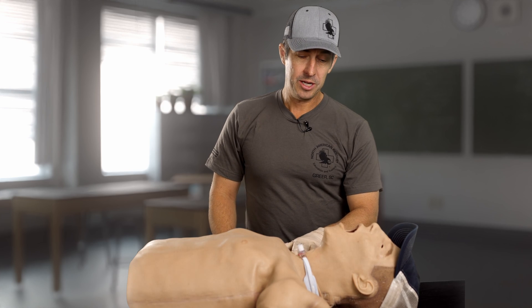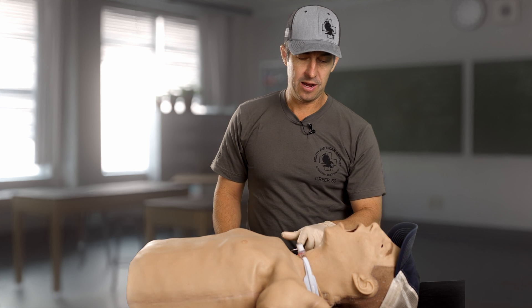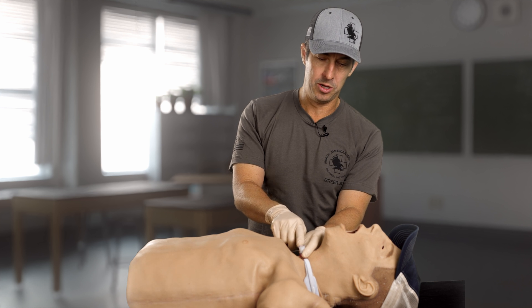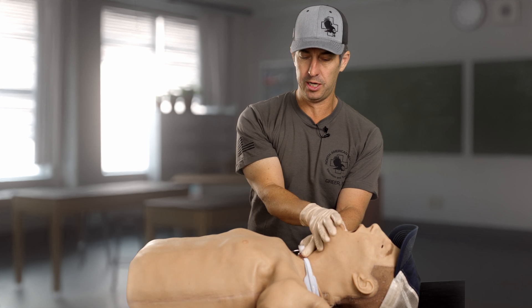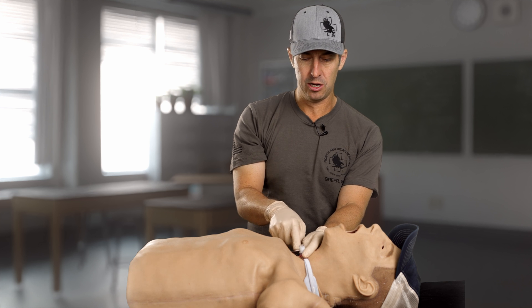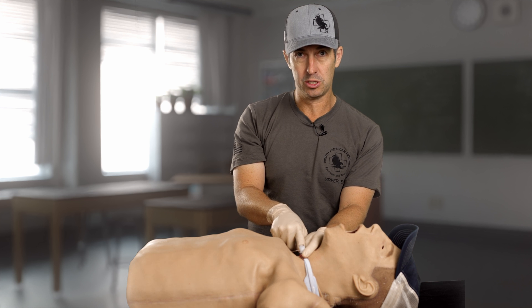You can see a cricothyroidotomy has been performed on this patient — it's in place and secure. What I've done here is I've made a way for air to travel into this tube, bypassing the mouth, upper throat, posterior pharynx, any trauma, any blood, any issues going on there. I've bypassed all that and made an opening to the outside, so now I can breathe for my patient, or my patient can breathe on their own through this tube.